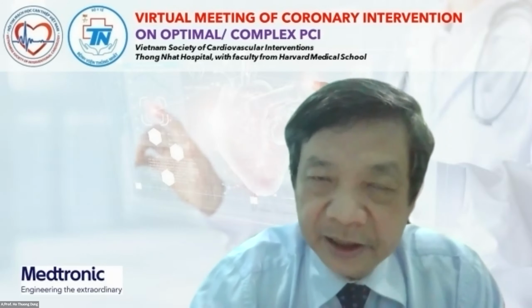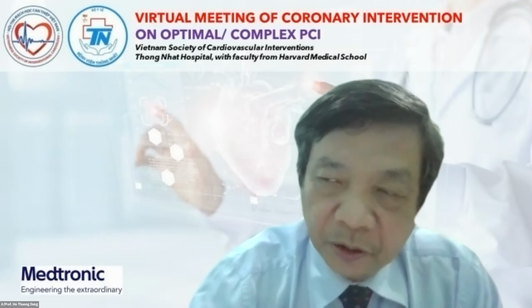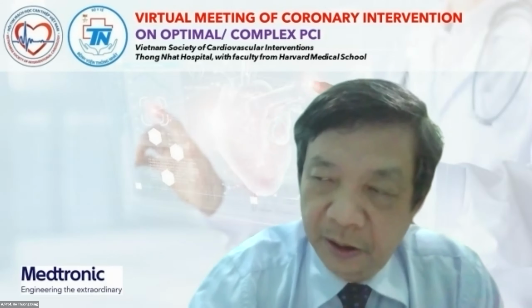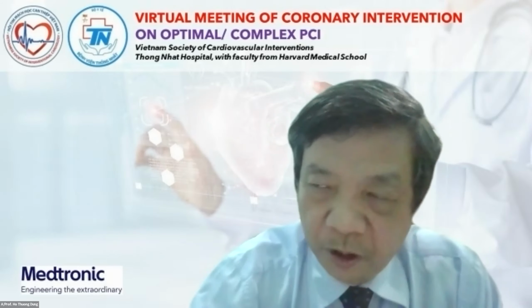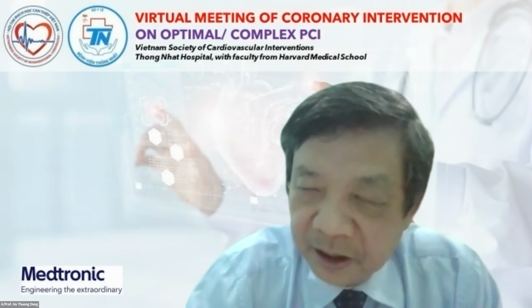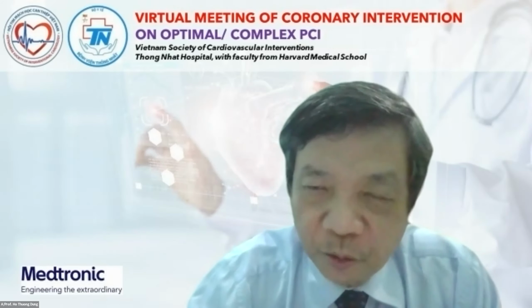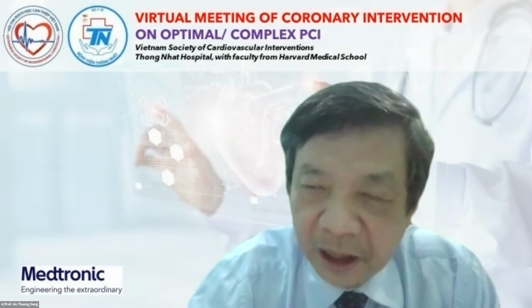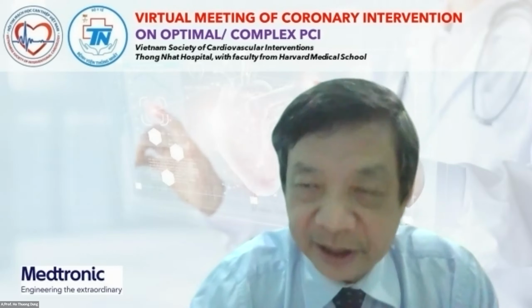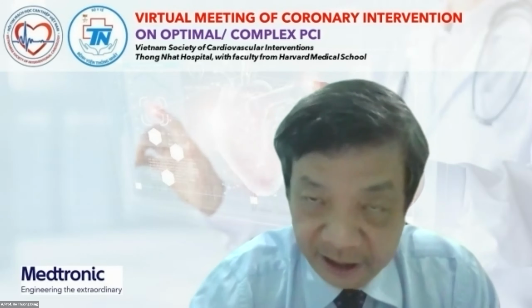But the disadvantage of the OCT, like Professor Tang talked about, is in patients with chronic kidney disease, because as you know, to record a very good image, we must push the contrast strong enough. Sometimes the assistant cannot push strong enough. We must record 2 or 3 times again. It uses a large amount of contrast, and is not good for chronic kidney disease.